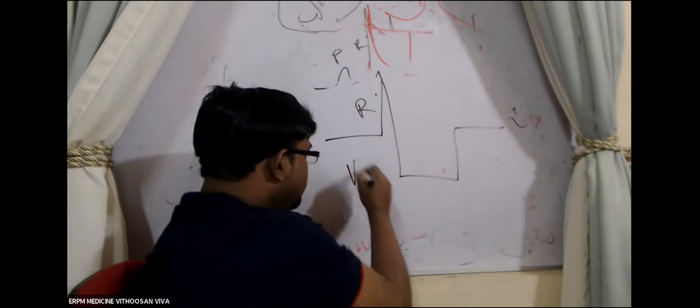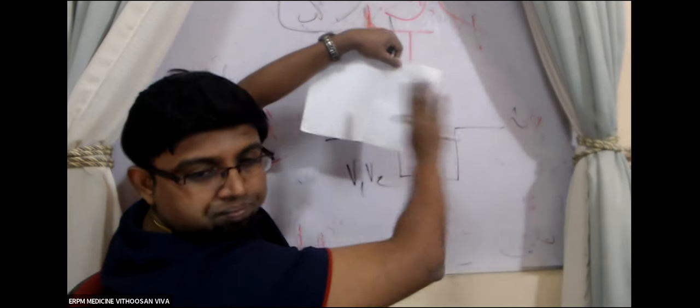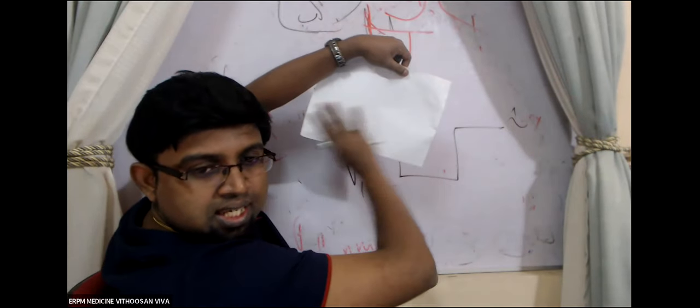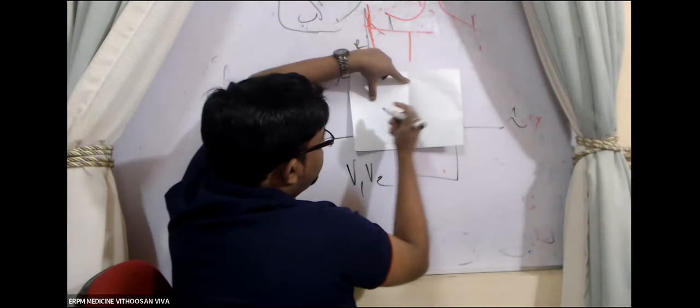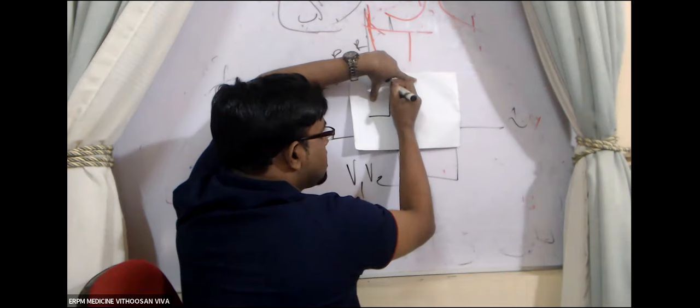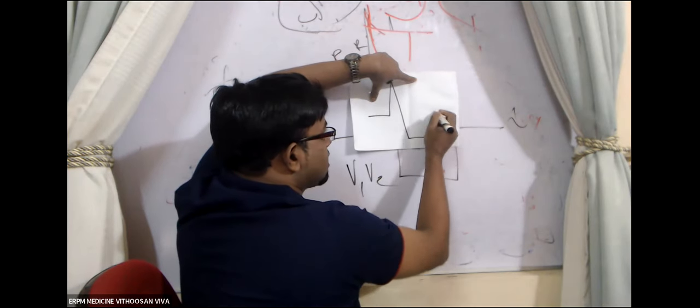Remember guys, look at me. Just think this is the ECG paper. If you look at V1, V2, they will be like this.